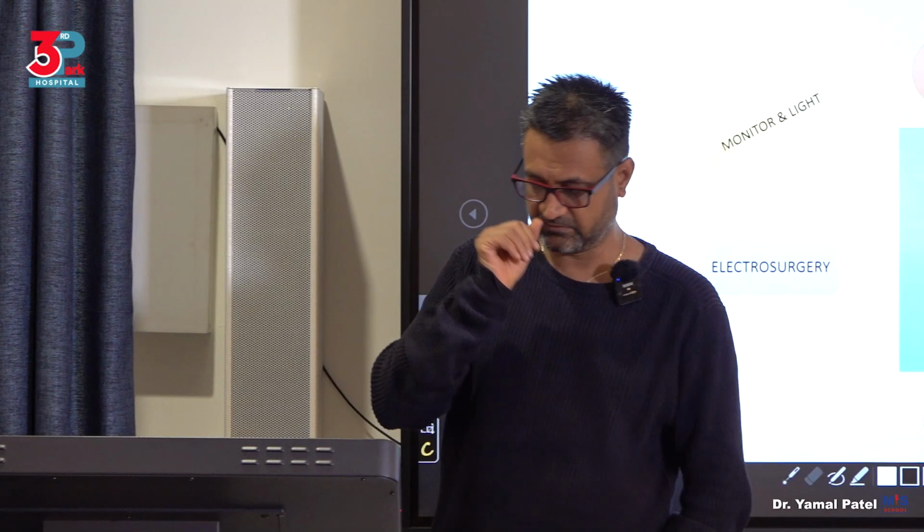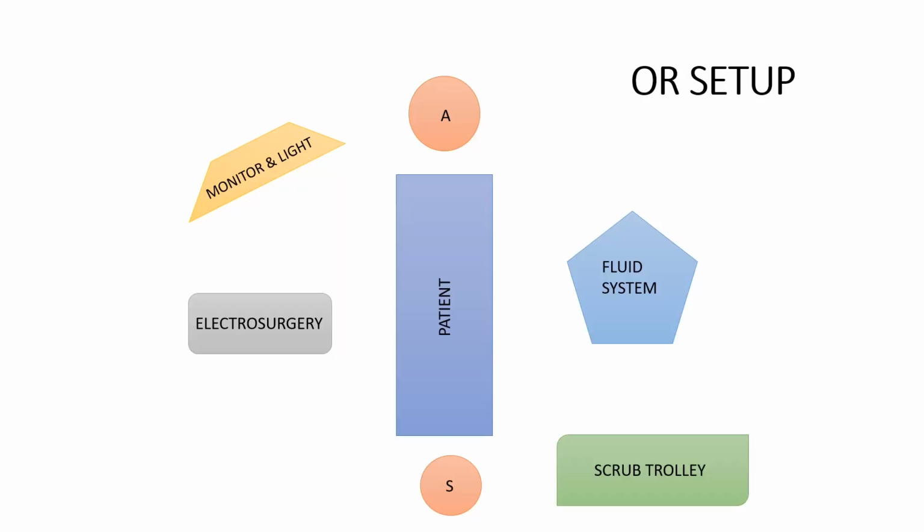So what is the engineering around hysteroscopy? Well, it's the table and the OR setup, how we will be positioning ourselves, where will be the fluid distending media placed and how it works, what is the equipment around the hysteroscopy, that is the hysteroscope, and the setting up and the dismantling of the scopes and everything.